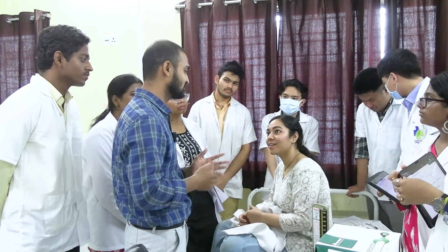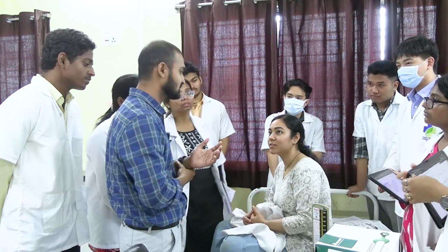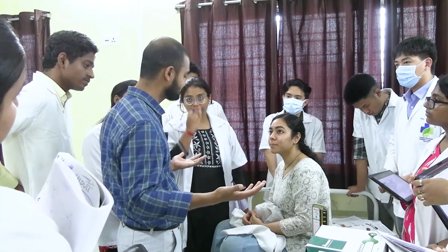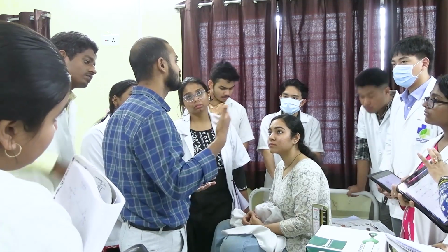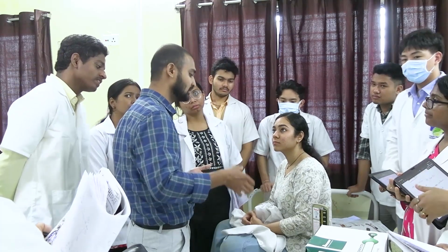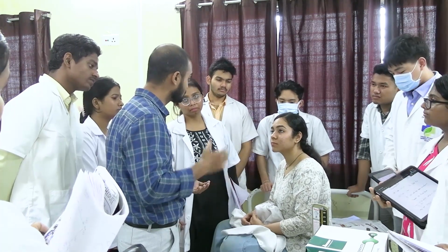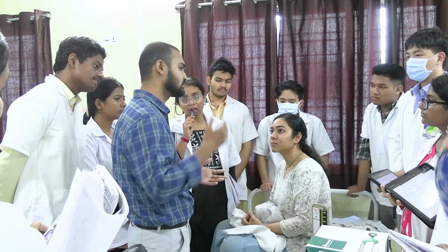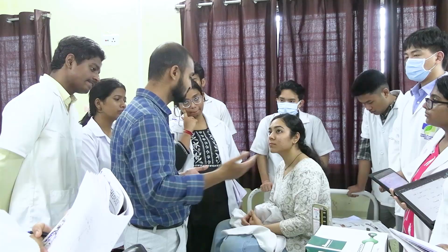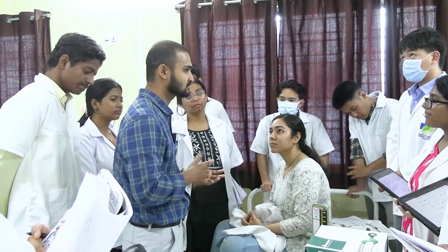The disadvantage part. Advantage I told, it will help you. Suppose the patient is hypertensive and the patient's BP is around, suppose take 280. Suppose you have inflated the cuff till 200 or 250. So you will be getting the beat, the sounds, various sounds. I will be coming to that, how the sound feels.